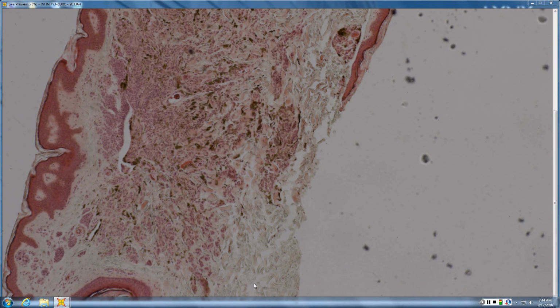You could also do a Ki-67, which looks at cell proliferation, usually less than 10% for benign lesions, usually greater than 10% for melanoma. Now, does that hold true for pediatric populations? It actually does, even in the pediatric population. In pediatric lesions and traumatized lesions and things like that, you may have more mitoses high, but seldom deep. So 5% deep, 10% overall is usually badness.